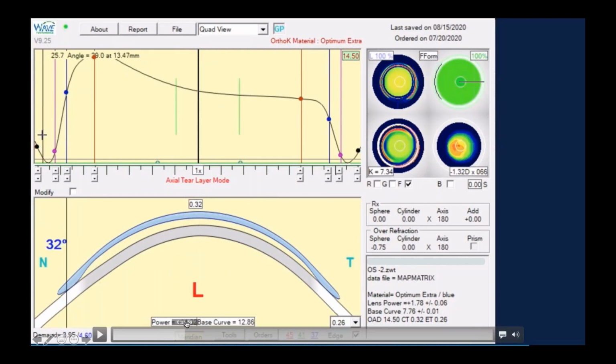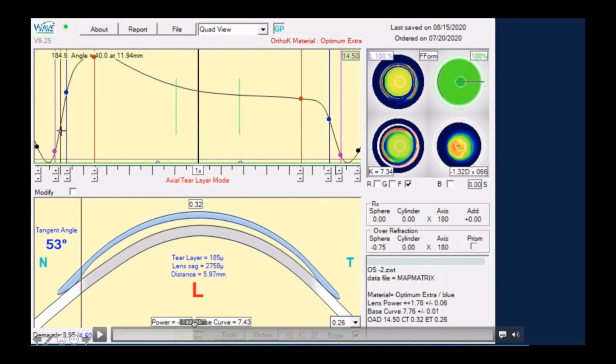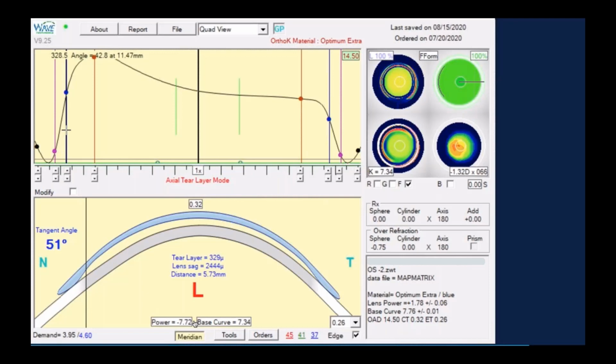So here we are. We're going to measure the height right here. So of course, when you look at that OCT, or if you're using good skills with your slit lamp and fluorescein patterns, which is very achievable, you're looking at this area here. And what we saw in the OCT is that this is not exactly how it worked out, right? The sclera is covered by some very boggy conjunctiva, and those are just some limitations that we have to deal with.